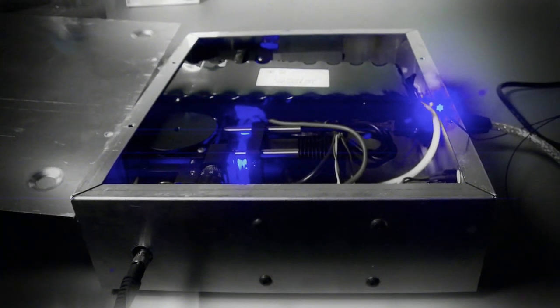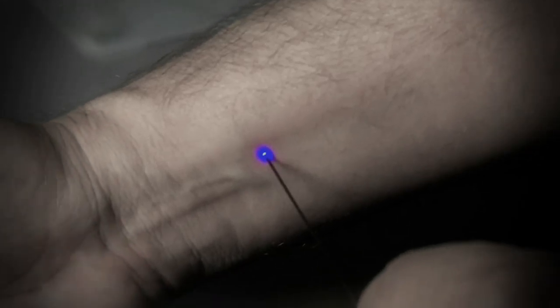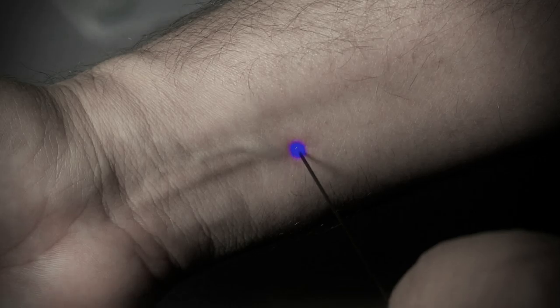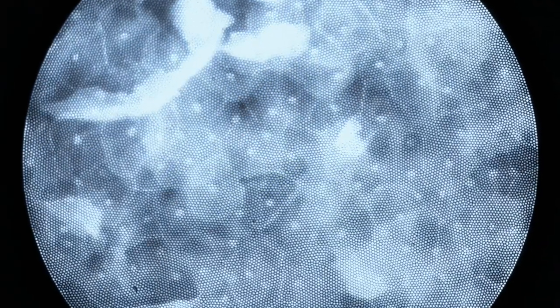We have developed a battery-powered, low-cost fiber optic microscope that allows the user to place the fiber probe on tissue and image the cells with subcellular resolution. What it allows you to do is identify precancerous lesions at the earliest stage when they are most amenable to inexpensive treatment.